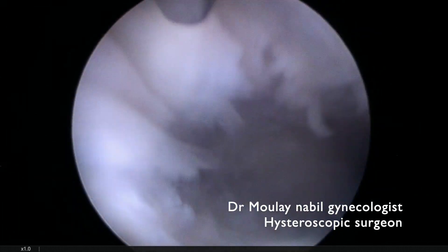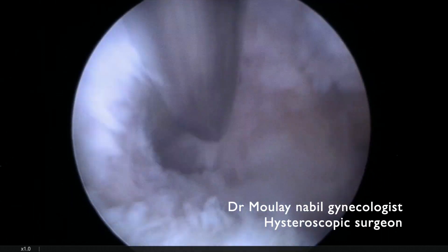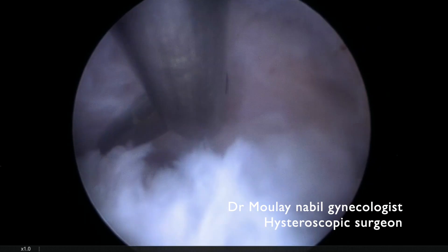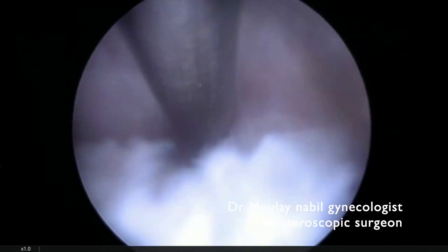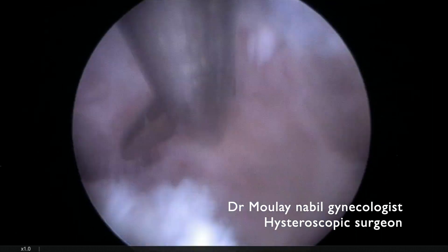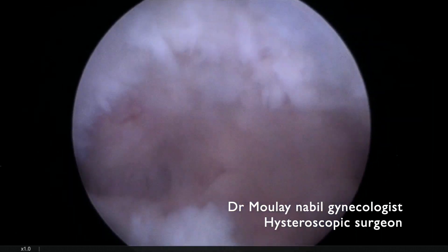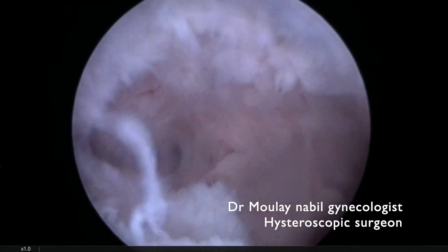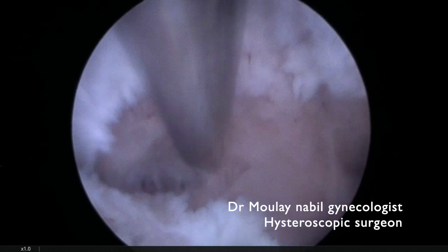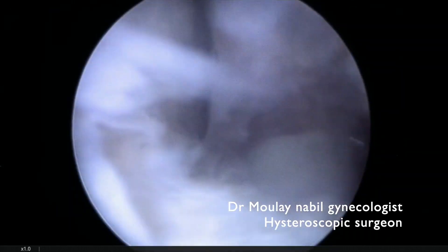It's important to stay parallel between the two anterior and posterior uterine aspects. We cut until we reach the myometrial vessels. As you see, we decrease the uterine pressure to check whether there is any artery or vein that bleeds.